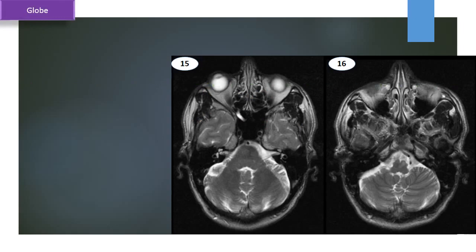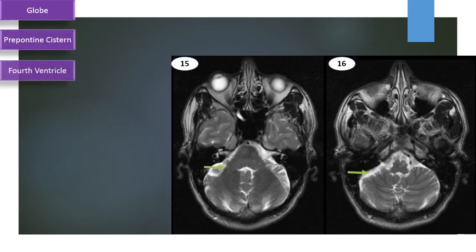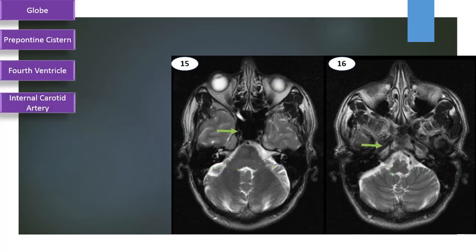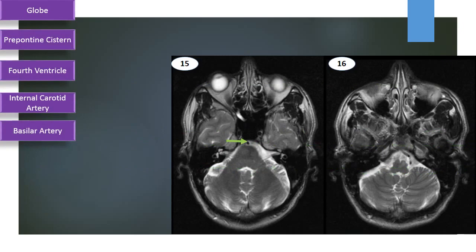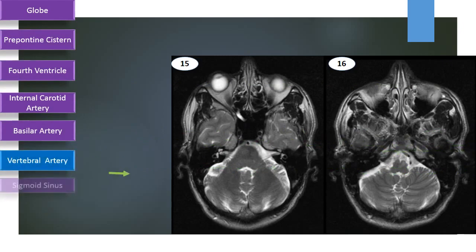Optic globe, prepontine cistern, fourth ventricle, internal carotid artery, basilar artery in the prepontine cistern, vertebral artery, sigmoid sinus.